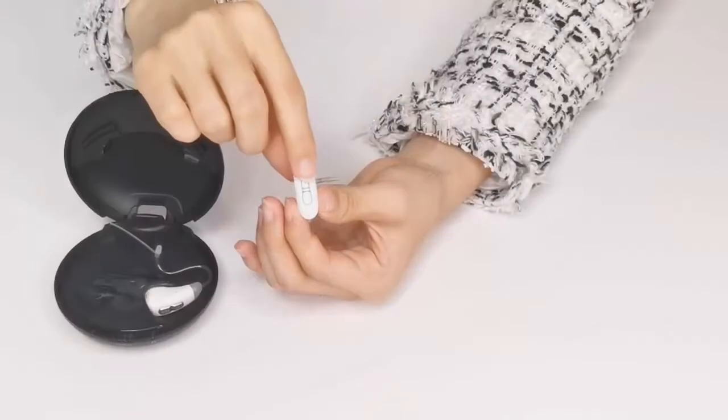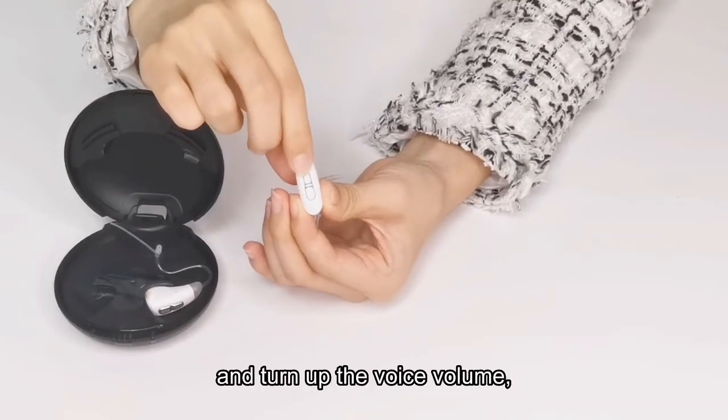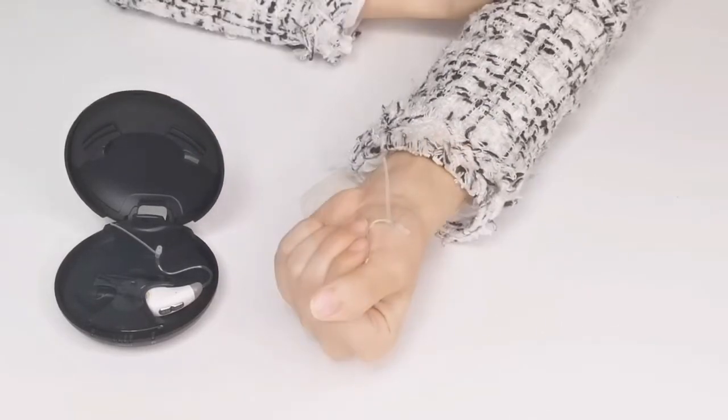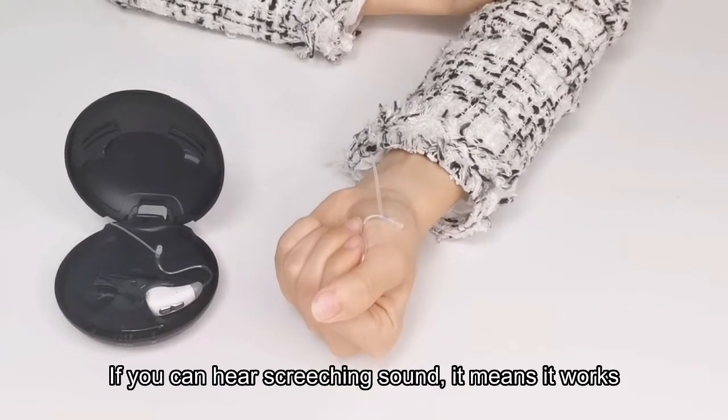Third, turn on and turn off the device, adjust the voice volume, and put it in your hand like this. If you can hear a screeching sound, it means it works.